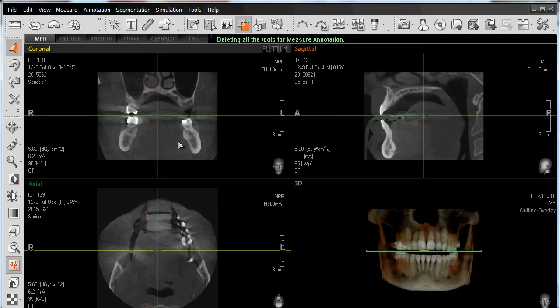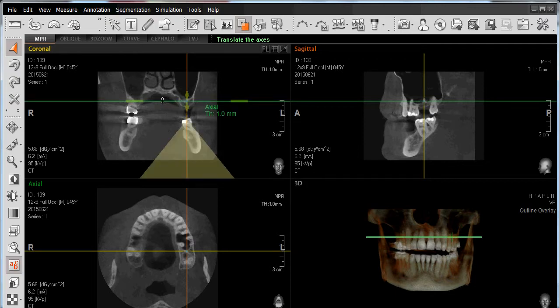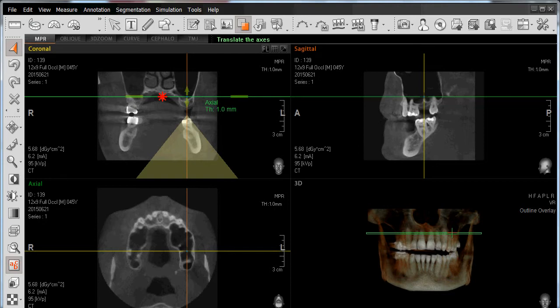Moving the mouse along any of these axis lines allows us to perform a number of different functions. Positioning the mouse on the intersection of two axis lines allows us to change multiple views simultaneously — in this case, the axial and sagittal views. Positioning the mouse further away from the intersection, where the arrow points in opposite directions, allows us to move that line up and down parallel to its orientation. Moving the mouse further along the line, where it changes to an arrow with two parallel lines, allows us to change the thickness of that anatomical view, in this case the axial window.